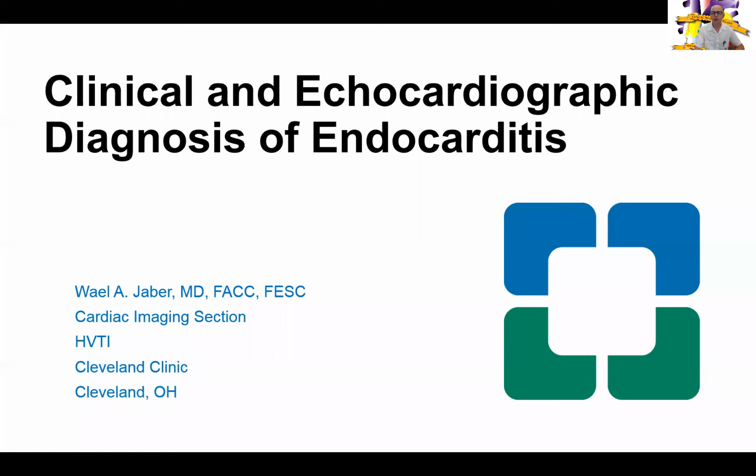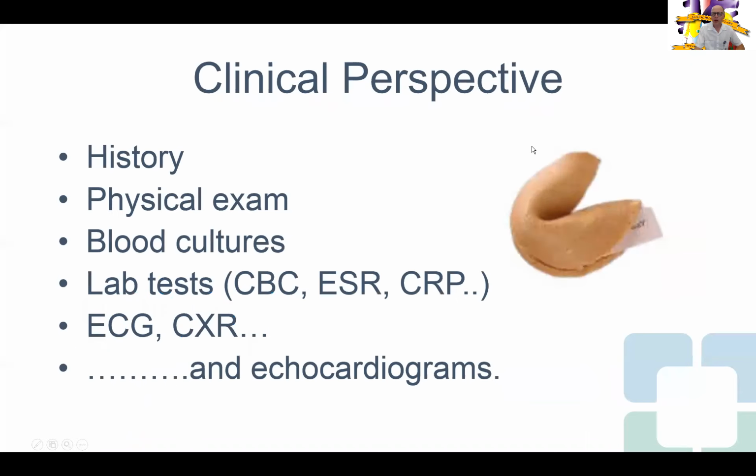In this session, we will discuss some clinical and echocardiographic features for the diagnosis of endocarditis. First, every time you're faced with the question of whether a patient has endocarditis or not, these are essential steps before you arrive at the diagnosis.